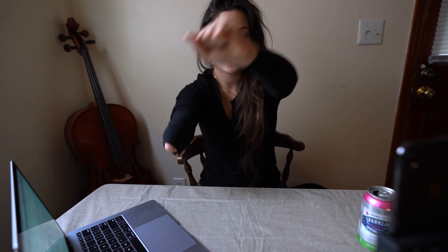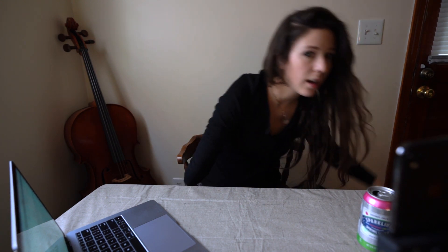Hey everybody, it's Abby. I am sitting here at my dining room table with my laptop and the box of goodies from Unlimited Tomorrow. I'm about to do my first virtual socket fitting appointment with Unlimited Tomorrow so that I can narrow down which one is fitting better and make little notes and adjustments so that we can move further in the process. I'm really excited to do this.